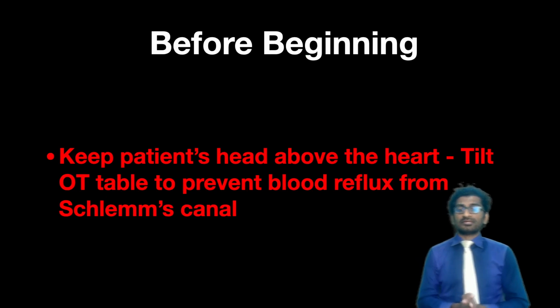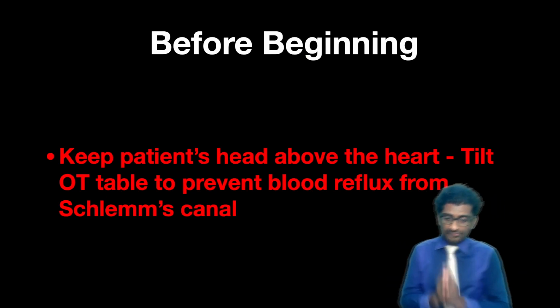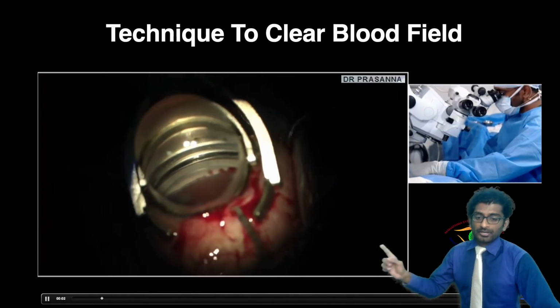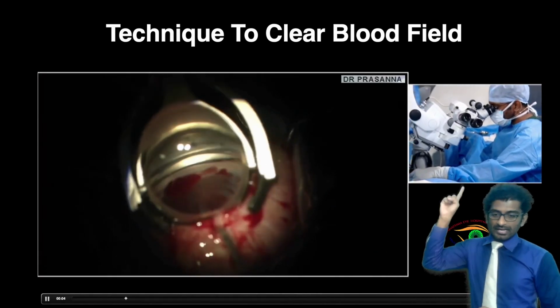Before beginning the procedure, keep the head above the heart of the patient. It is very important to prevent this. Another very important teaching video, this is outside and this is inside.